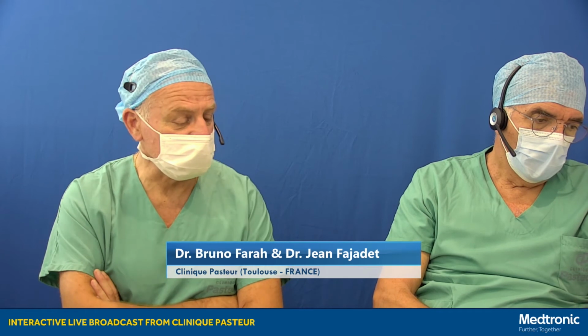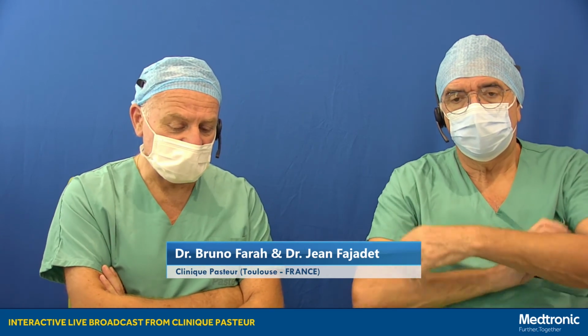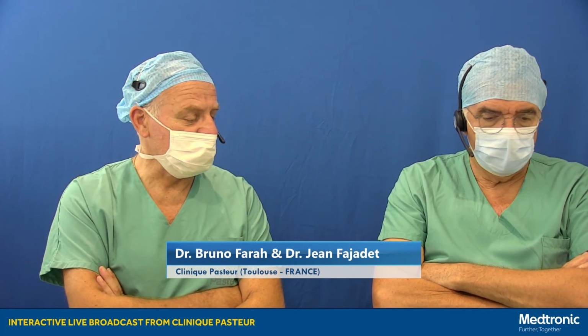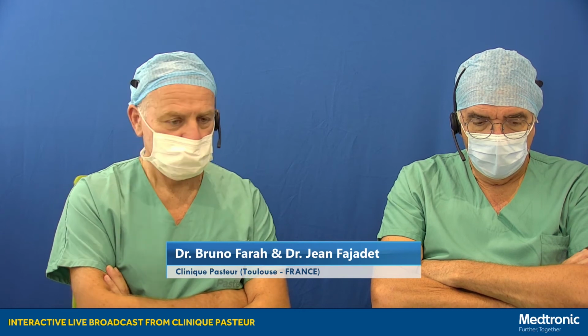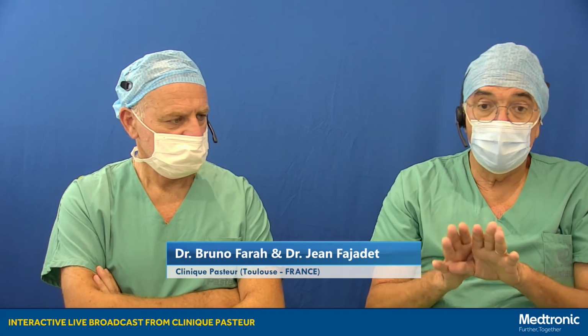Here, I think that the question is very good, because probably some of our colleagues will stop after the POT because the result seems acceptable. There is not really a lot of rationale to do the kissing, except that it was quite a large branch, and that sometimes favors doing the kissing. Yeah, I fully agree. The decision is related to the result that you obtain after the stent implantation and the POT, and second, the territory of this side branch, which in this case is a very large side branch.